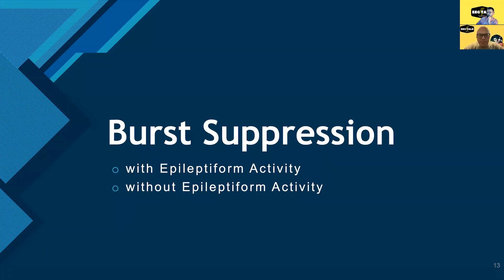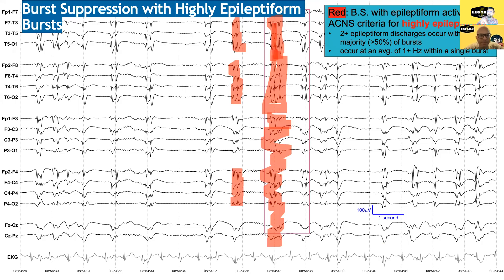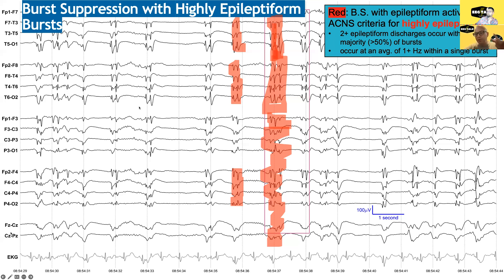Burst suppression can be further classified as with or without epileptiform activity. Looking at this example — if you count up how much of it is flat, it's close to 50%, so let's call it burst suppression. The bursts look very abnormal — they're full of epileptiform discharges, with complexes of maybe two or three. For it to be highly epileptiform burst suppression, all bursts must have at least two epileptiform discharges and they must occur at at least one Hz — both criteria must be met.